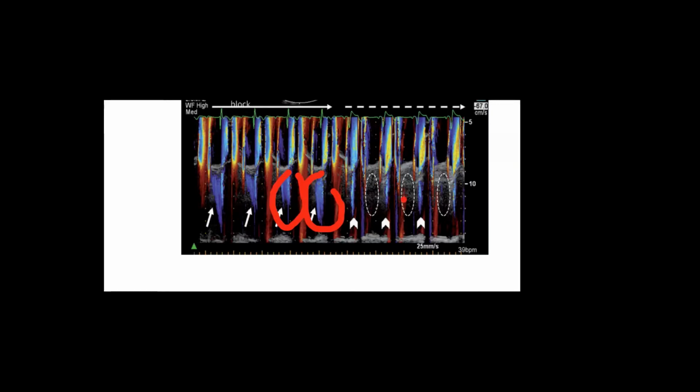Exactly. And this diastolic MR, when you follow it down here along the tracing, you see it is minimized and disappears. When you correlate that with the ECG, you see when I have diastolic MR, the ECG is different. That's an ECG effect on the diastolic MR. When you have first degree heart block, for example, you tend to have diastolic MR sometimes. And when you restore the PR interval, that MR will diminish or go away. Okay, so that's what is shown in here. A bit tough, that's why don't worry about it. It's not exam kind of stuff.